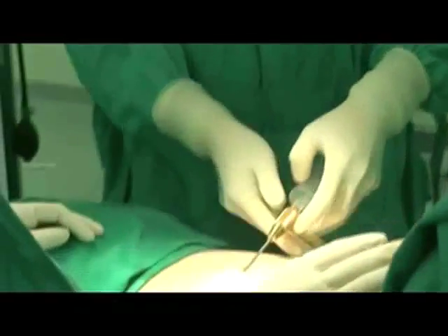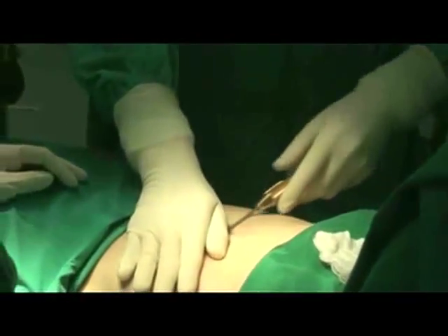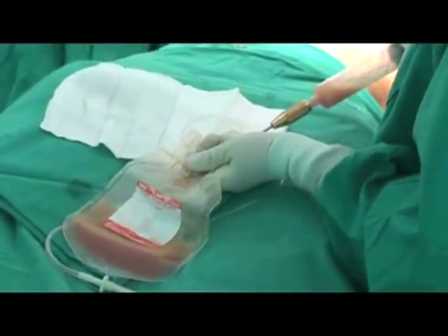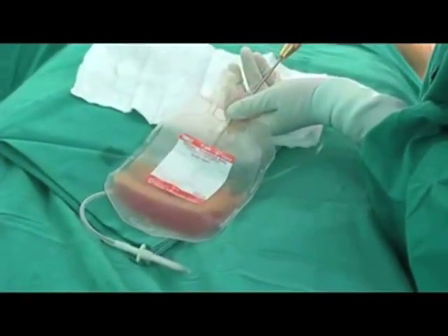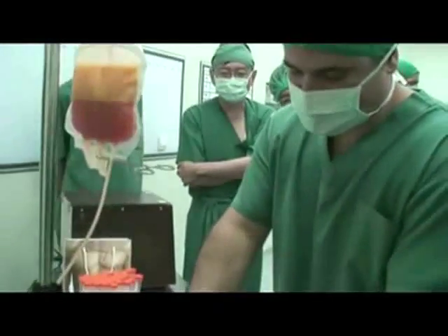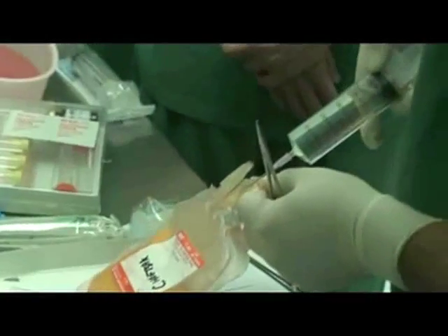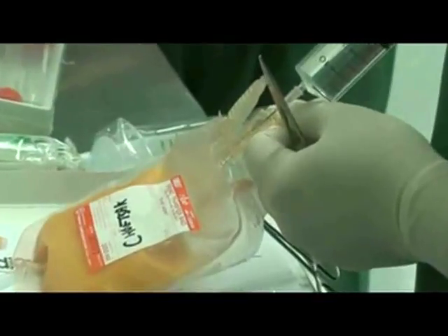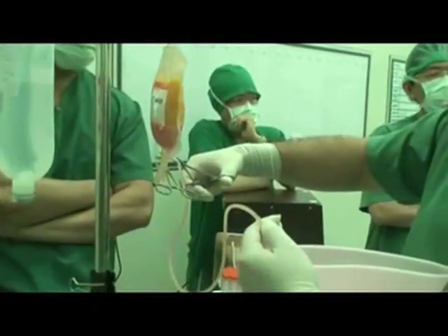Begin the manual liposuction procedure with a 3 millimeter cannula. 300 cc of fat must be extracted from the patient and placed into the Terumo bag provided in the AdiStem kit. Draw out the fluid from the fat and discard the fluid into a basin.